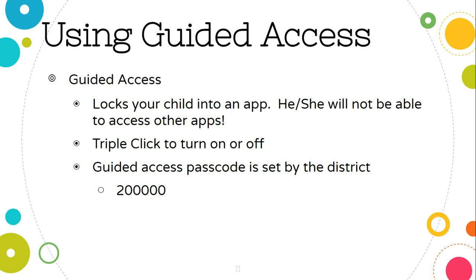So they would have the iPad that is given out to all kindergartners that has some educational materials on it. It may have some things specifically for them, but then things that go out to all kindergartners as a whole. And then they would have this iPad that is their dedicated AAC device. So we just want to make sure that we're using that at all times so that they understand what that looks like. And we also make sure that the cases look different and try to make sure that one looks a certain way and one looks a different way, so they have an idea of what things are for.